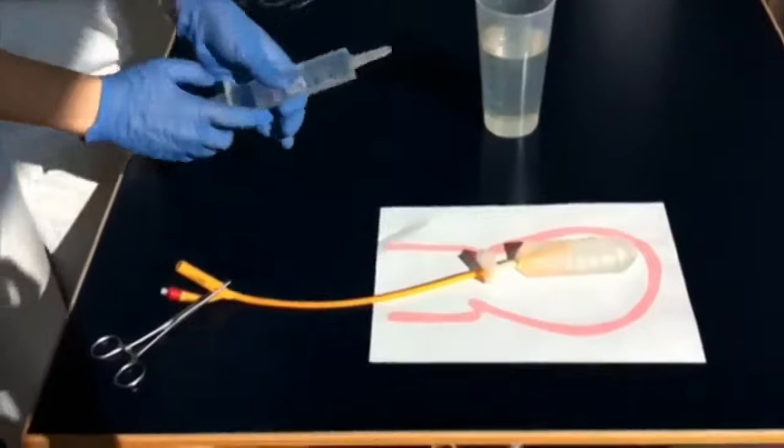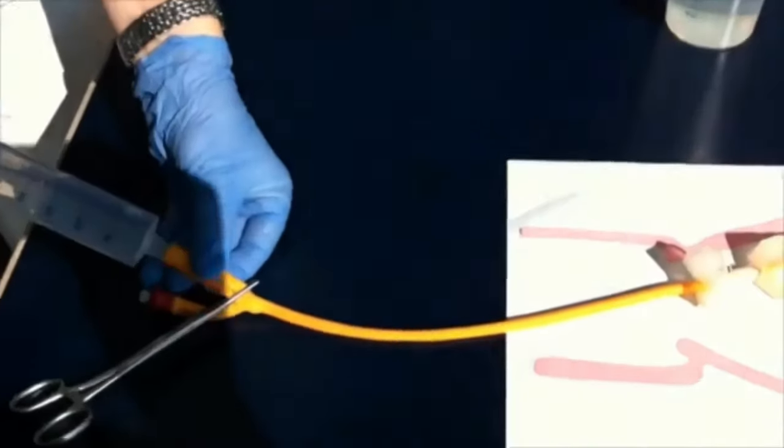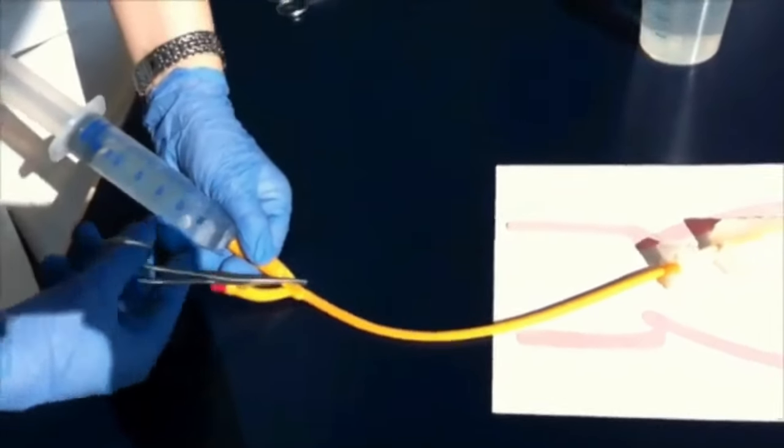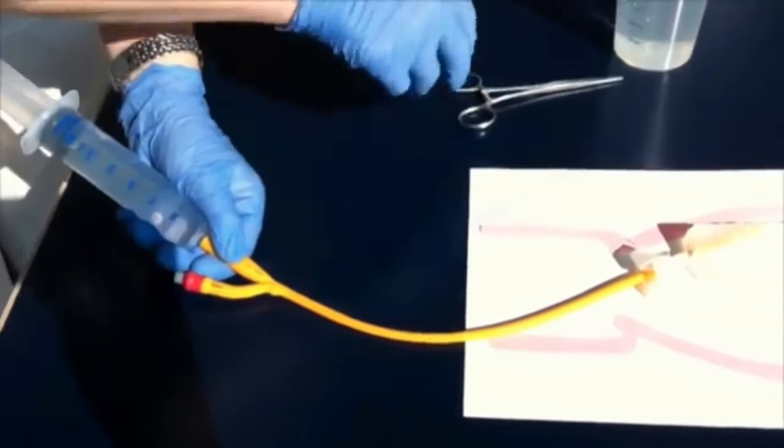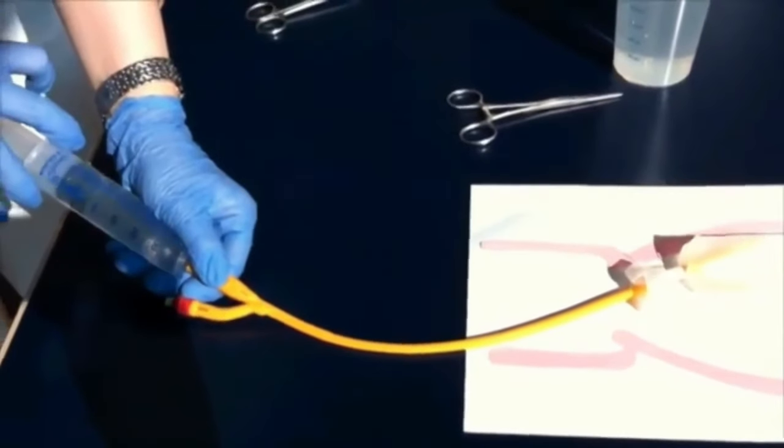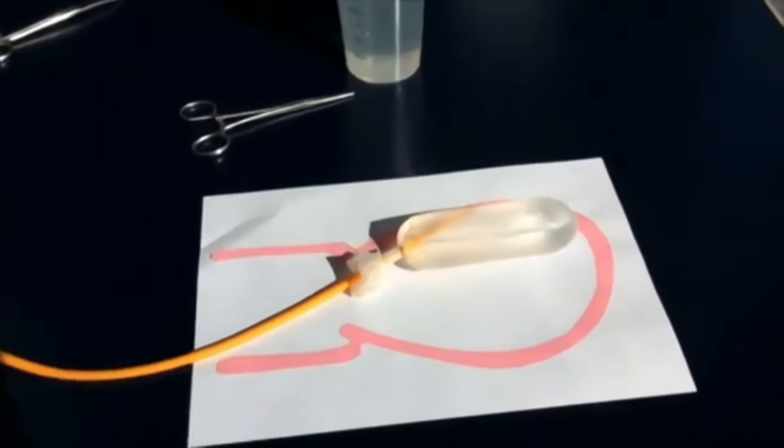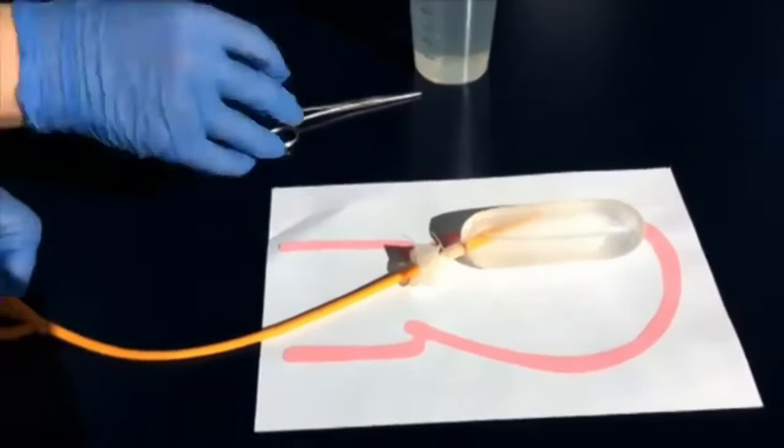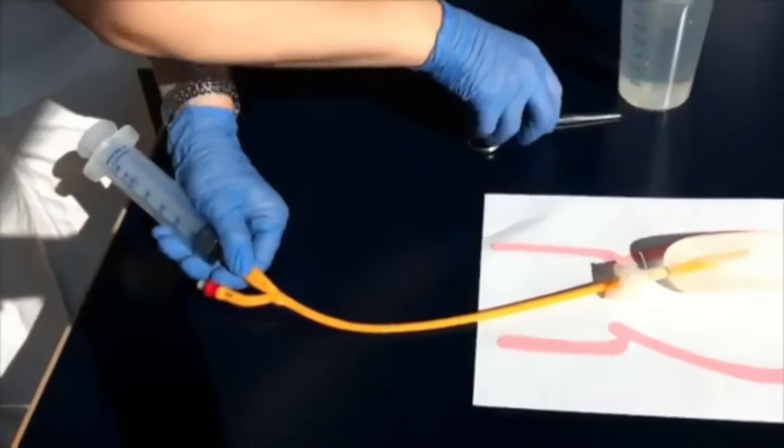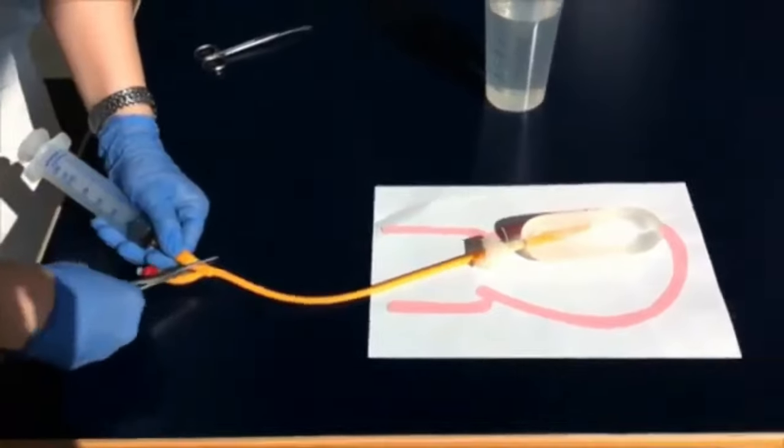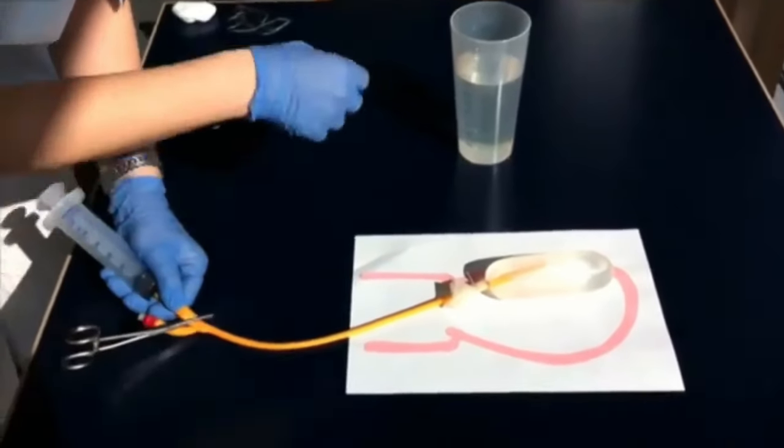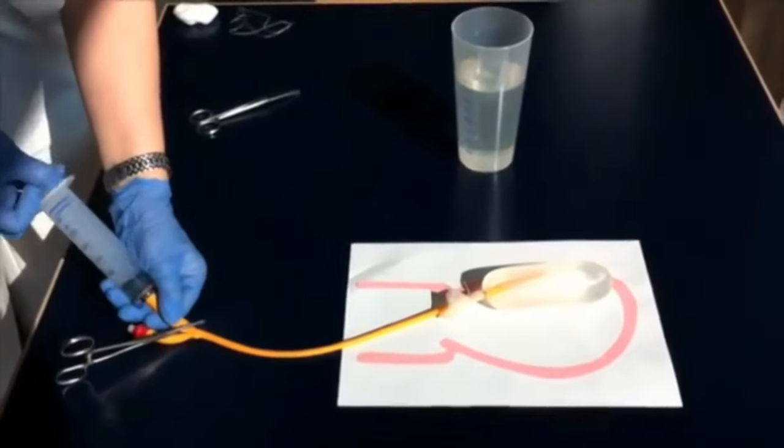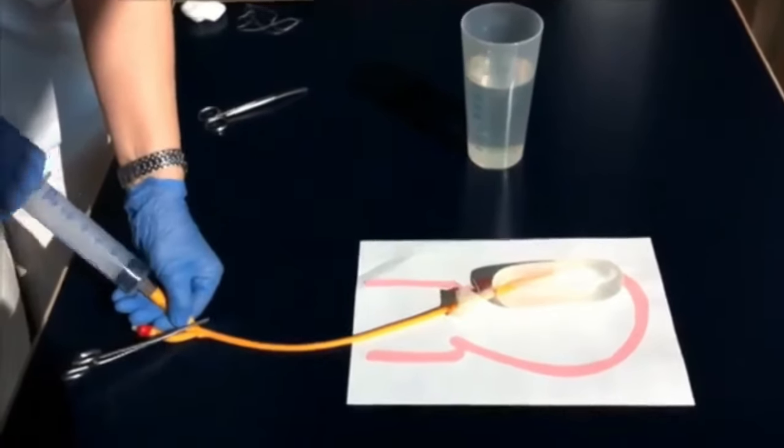This is a very important step because every time you have to give 50 ml to create a tamponade inside the uterus. The amount of ringer lactate which we can give is from 300 to 500 ml until the bleeding per vaginum stops. You can clamp it, or there are two parts you can see in this video.